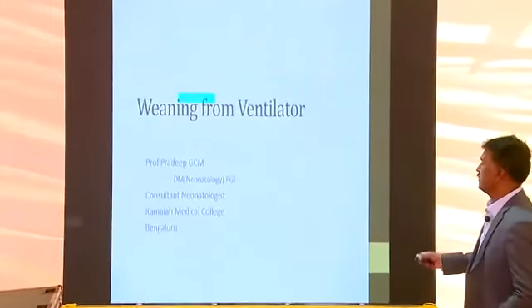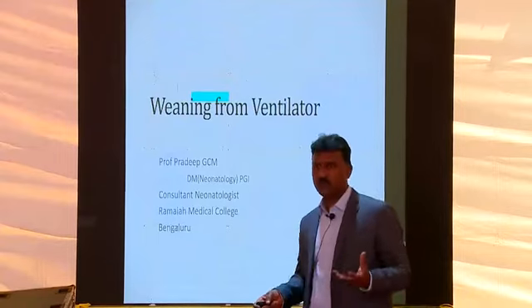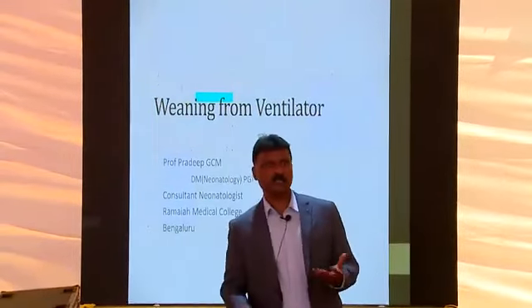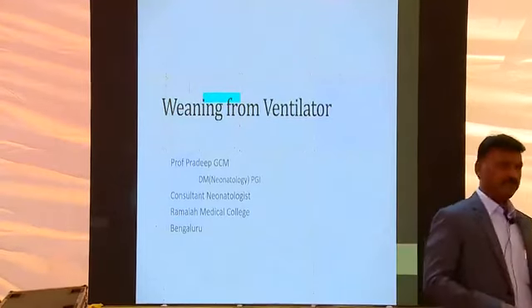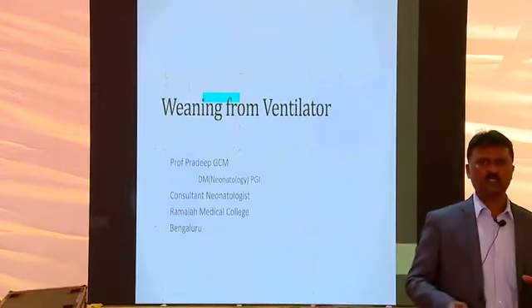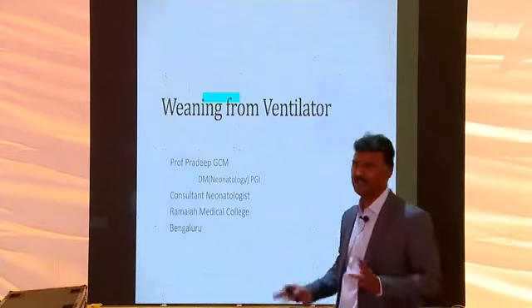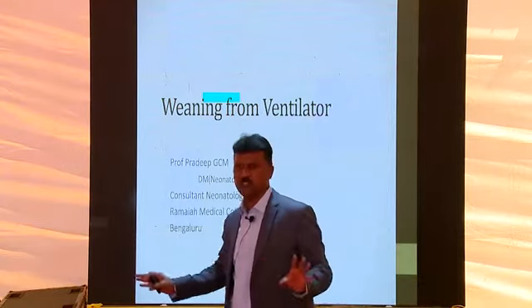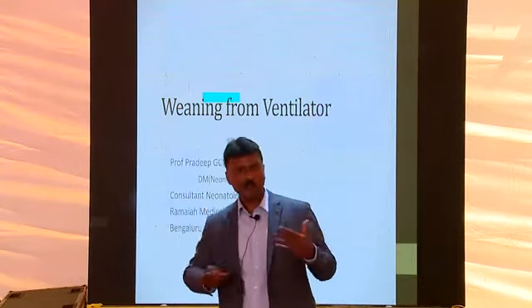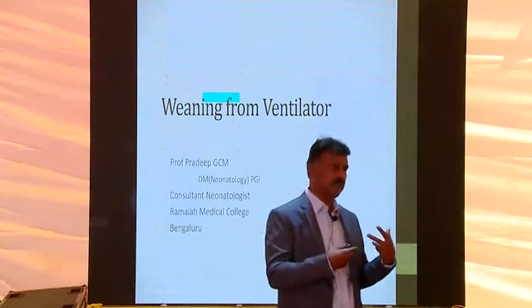Okay. So it's good to have your babies on a ventilator, but the risk of morbidity goes up with mechanical ventilation. Given an option, you do not want invasive ventilation. Given a choice, you would say I don't want it. It will be better for your babies and for yourself. You are more relaxed when babies are on CPAP than on a ventilator.